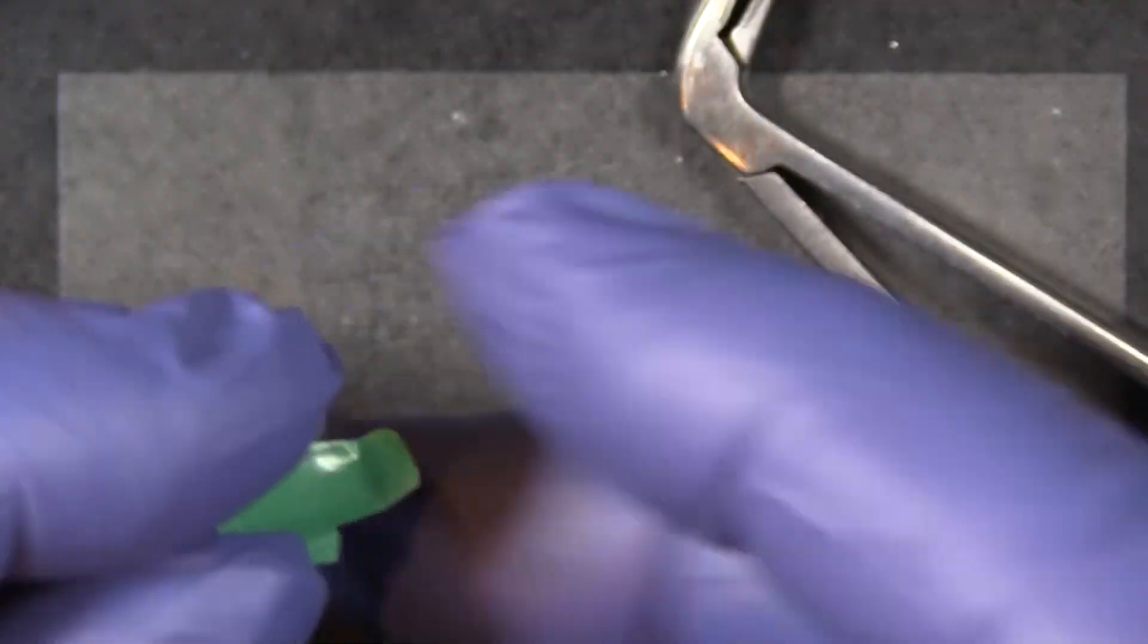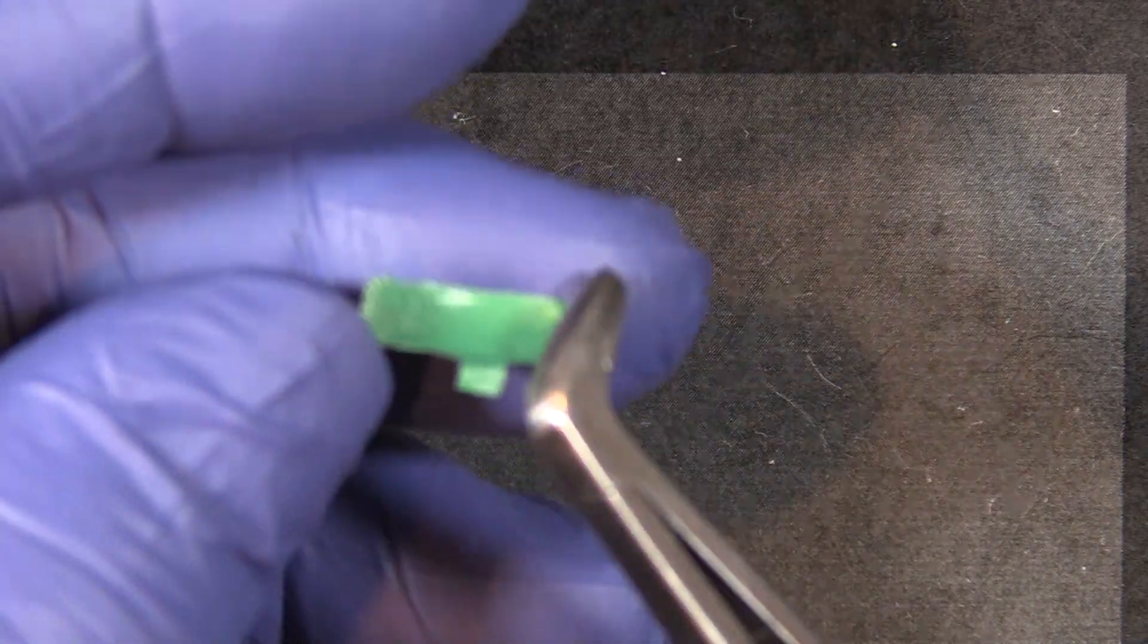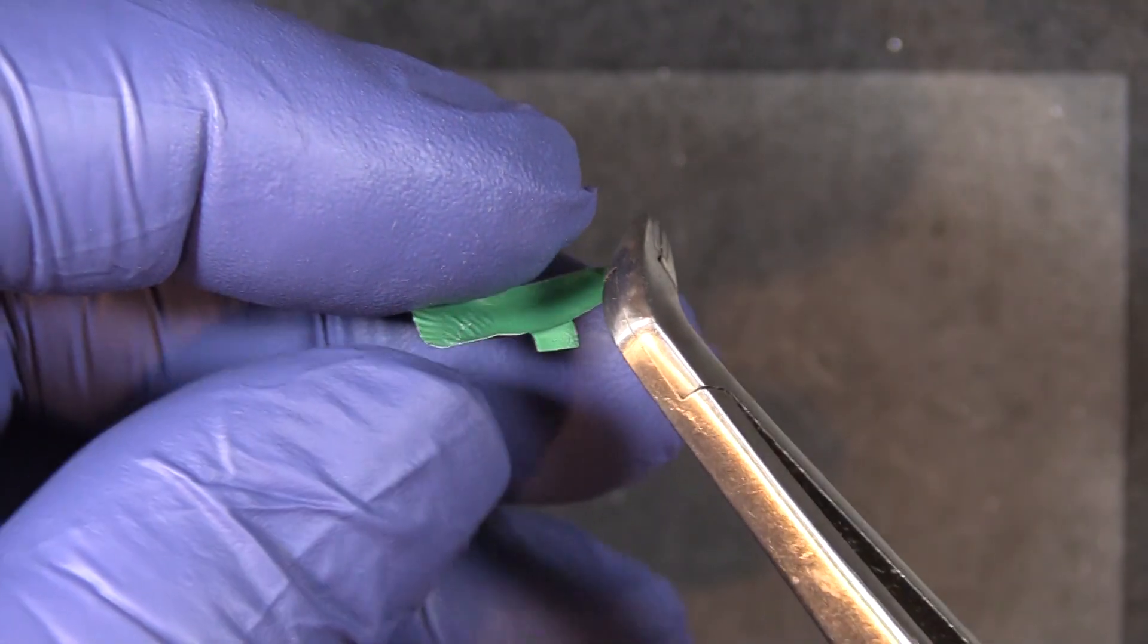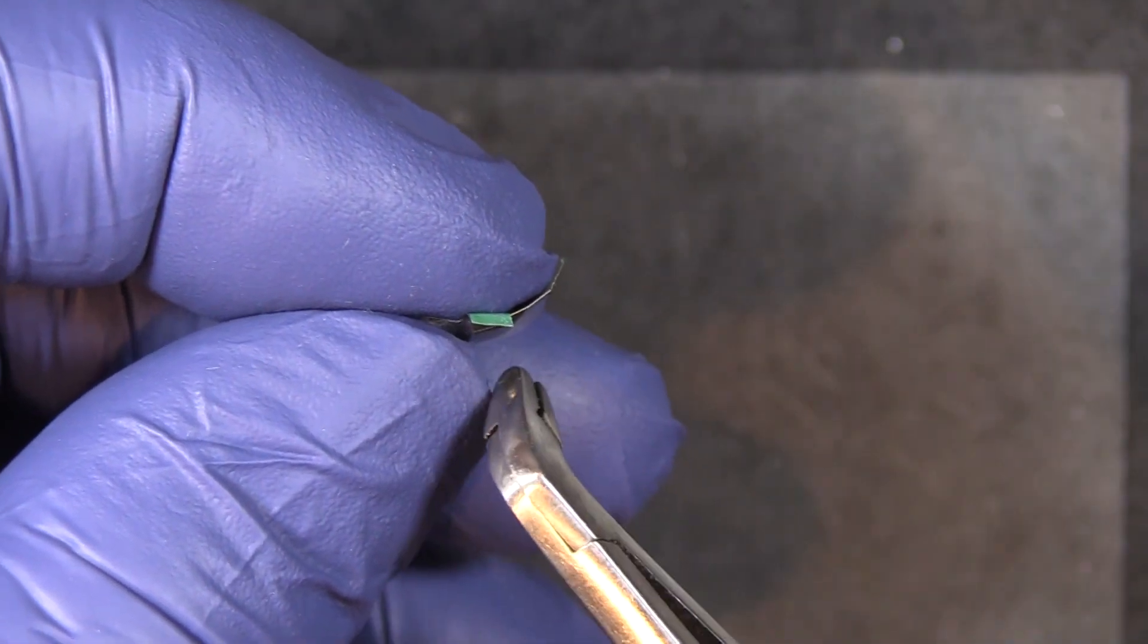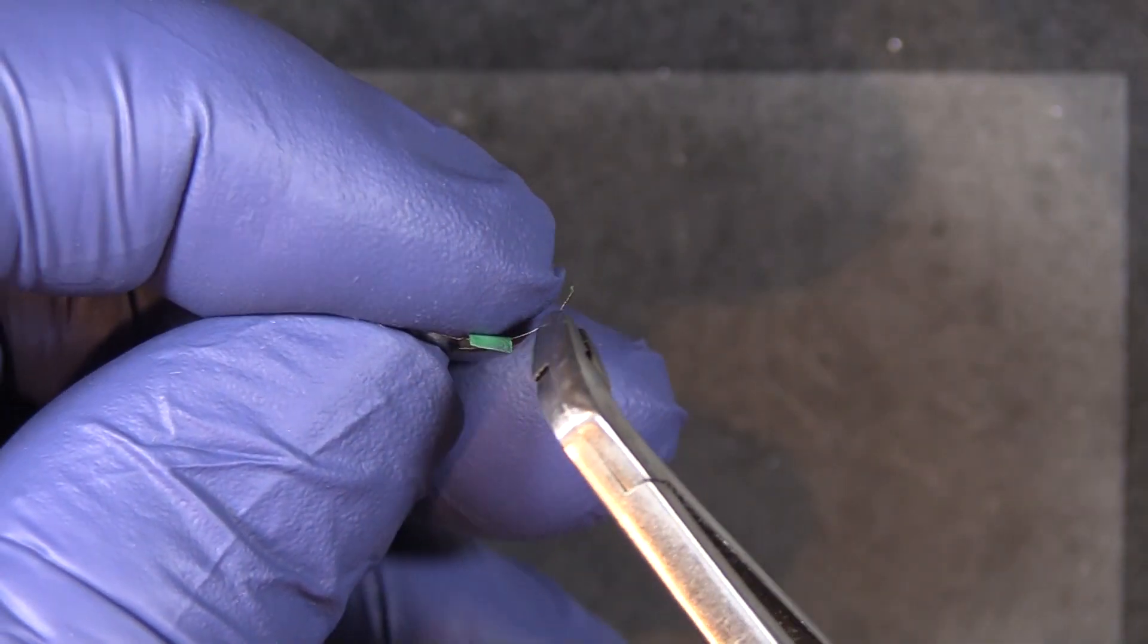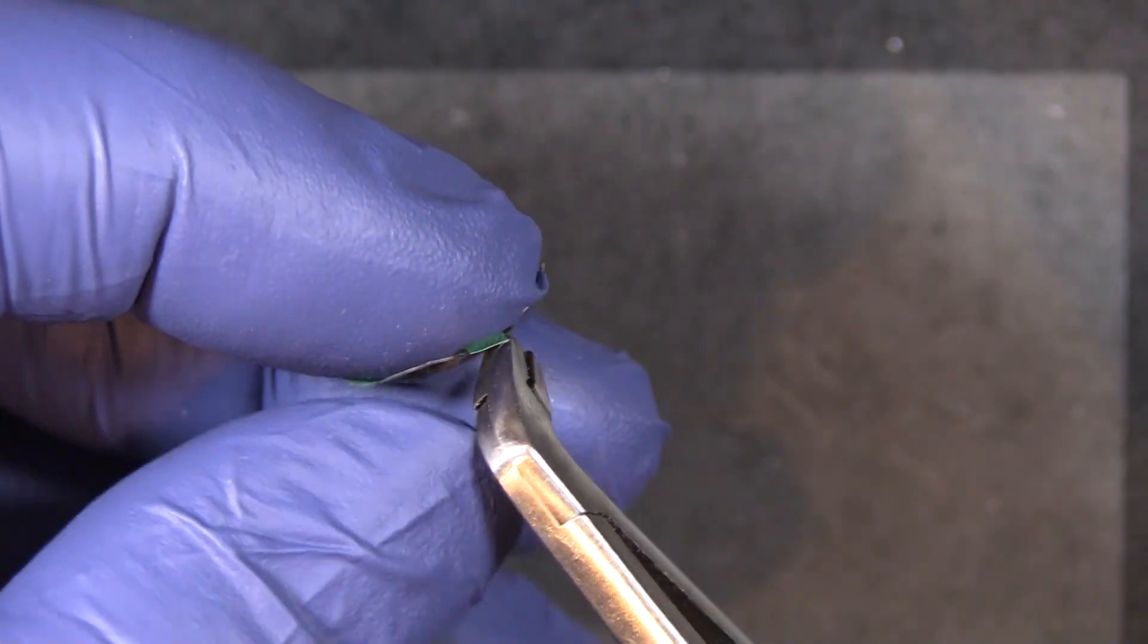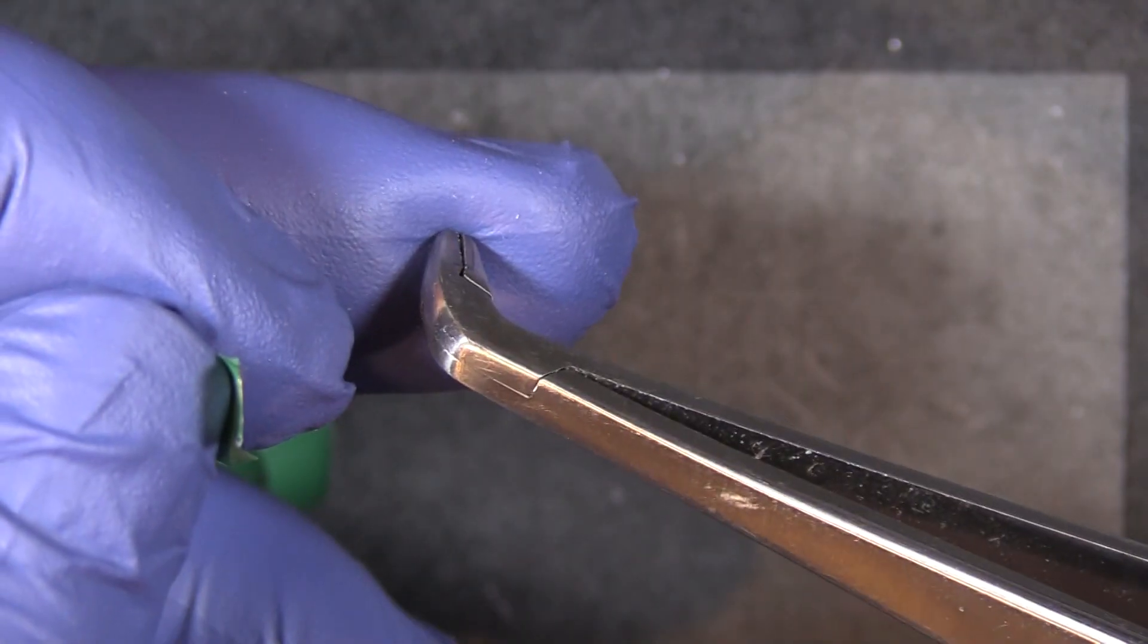You can pull a matrix band out of a hemostat with these things. The last thing you want to do is slip and inadvertently tear part of the matrix band off because if you've got a little sliver left in the interproximal space, it can be very difficult to get that out. So BFA from Garrison Dental Solutions.